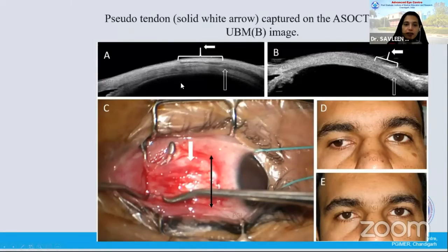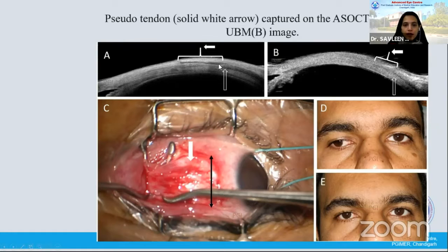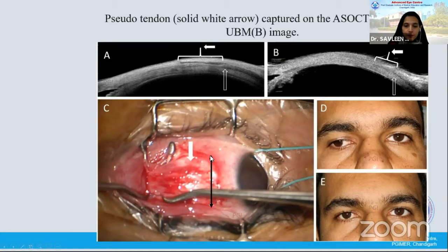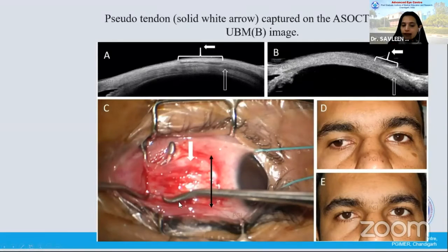We could also identify scars, stretch scars, and pseudotendons on the ASOCT. You can see that this is the scar or pseudotendon from the previous surgery and this is where the actual muscle starts on the ASOCT, whereas on the UBM the pseudotendon is not very clear. In the same patient, you can see where the original insertion was, with the previous surgery leading to a stretch scar, and the arrow now shows where the muscle is — this is the medial rectus being imaged.